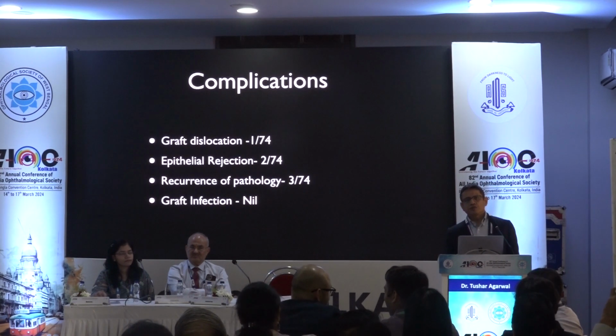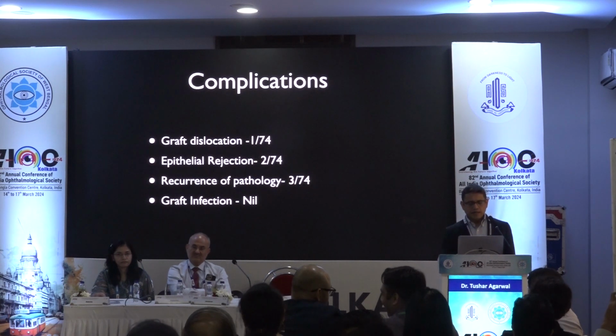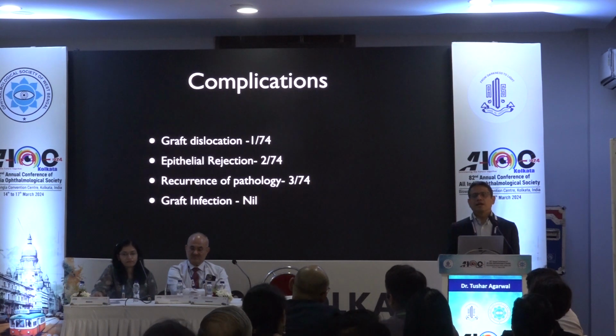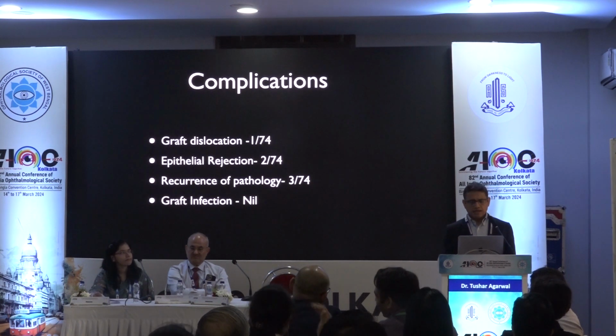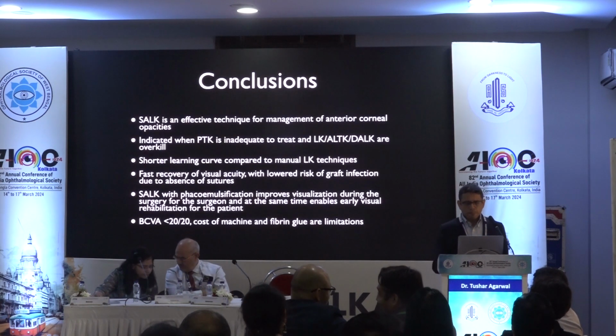The complications which you can expect in these cases are epithelial rejection, which we have seen, and recurrence of pathology, especially things like granular dystrophies, they come back. We haven't encountered any cases of graft infection as yet.